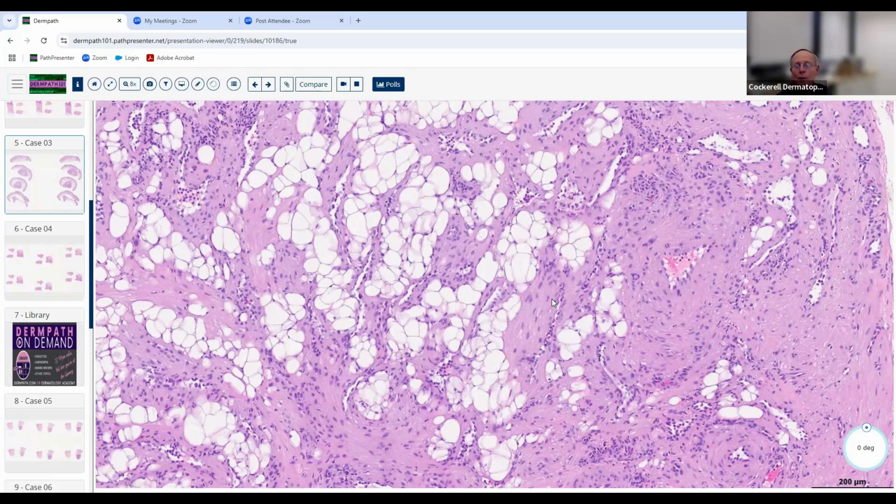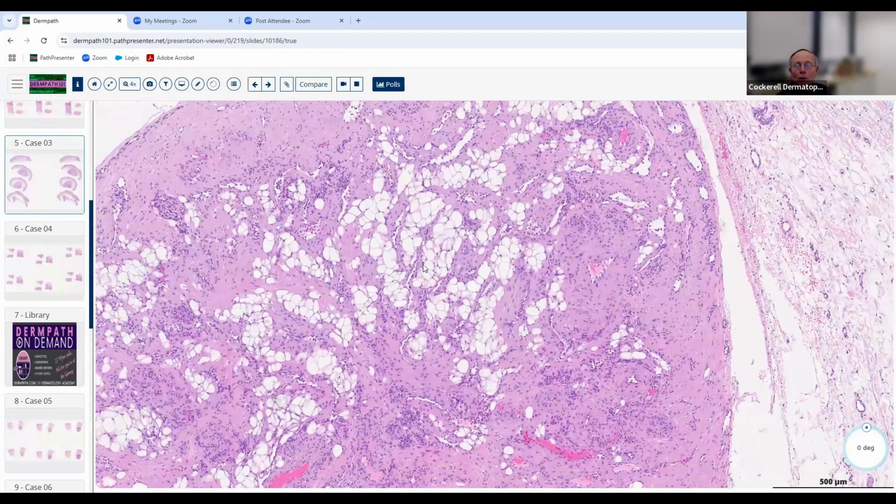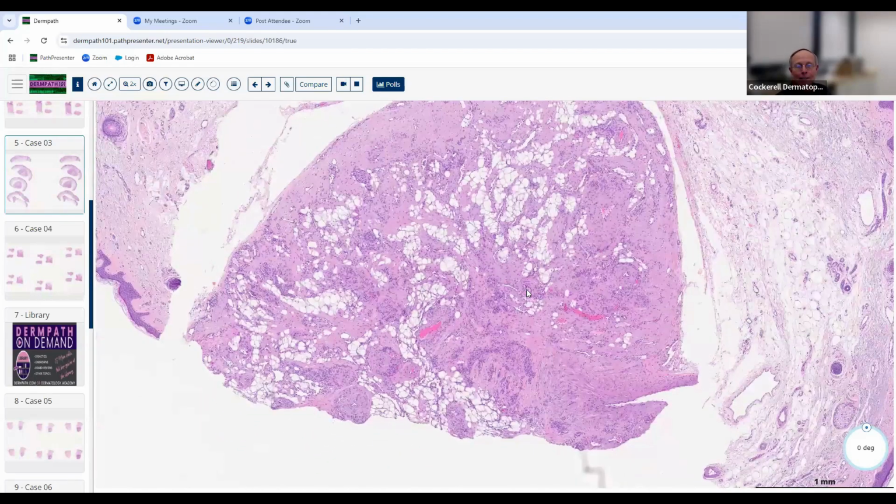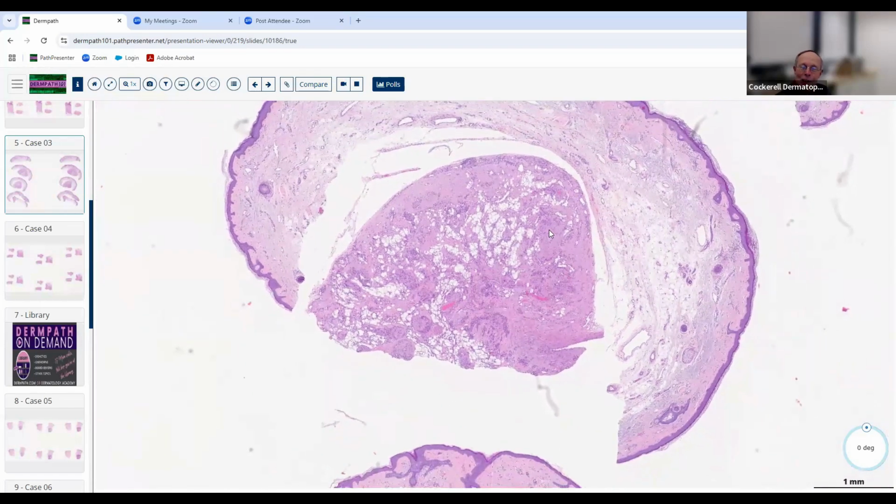And of course, you need to know everything there is to know about TS. You need to know all the clinical manifestations, the dental manifestations, the brain X-ray, basal ganglia calcification manifestations, and the gene of this. So just make sure that you know all of that for the board examination, because they will ask you about that. Okay, good. So that's an angiomyolipoma, a very rare entity. For every one of these, we probably see 10,000 just garden variety angioleiomyomas. I don't know if these are as painful or not because there aren't that many of them that we see. But theoretically, you think maybe it is painful.